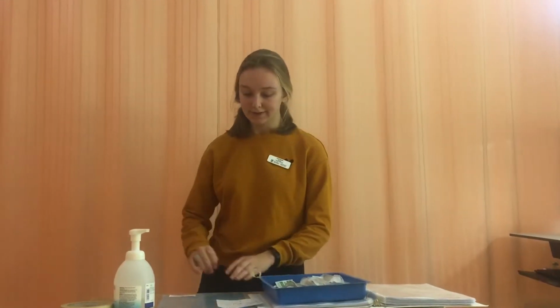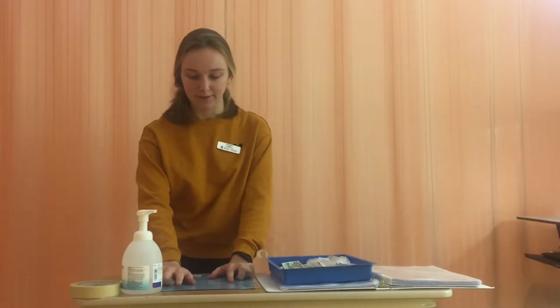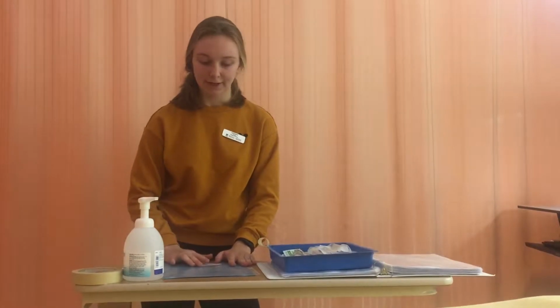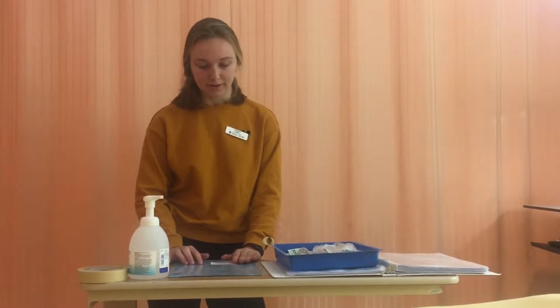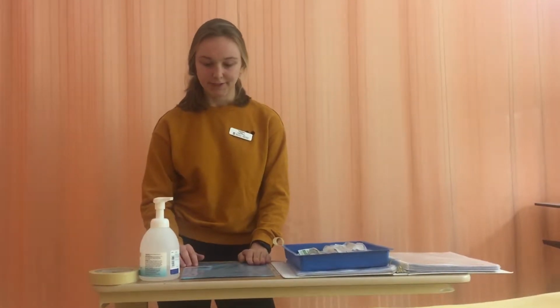I'm a third-year nursing student, and today I'm going to be reconstituting and further diluting a medication and giving it via mini bag. So the first thing I'm going to do is look at the MAR and the patient's information. So we have Emma Wrightson, and she got scratched by her cat, and it's getting infected. So we're just going to be giving her some Penicillin G for the infection. She has no known allergies and no other contraindications to taking the medication.